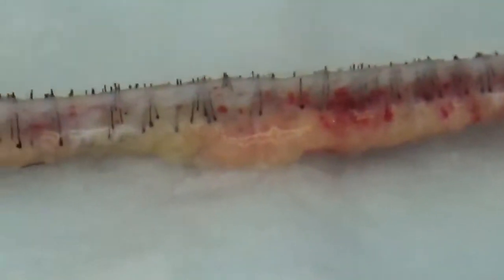We keep these grafts, when they're out like this, constantly hydrated. People don't realize, but they don't sit out on our table long. This is just for the camera, and that's why it's wet in the background, because we're constantly hydrating the strips, just to show the camera now. Anything you want to add?